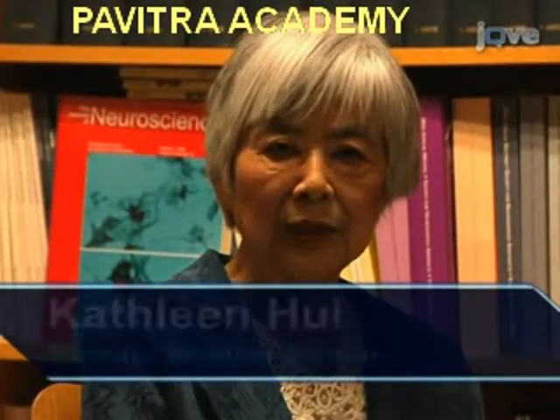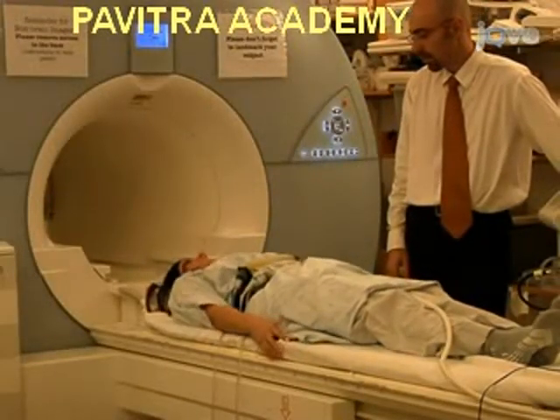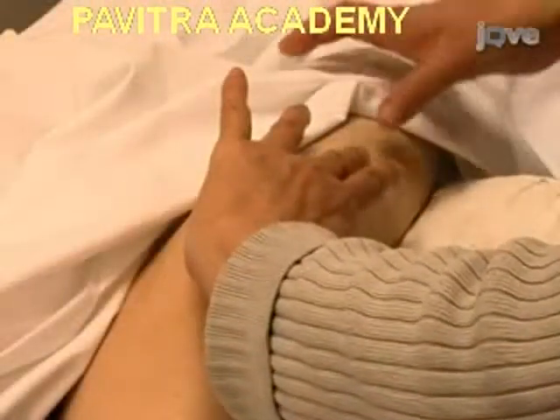Hi, I'm Kathleen Hui from the Martino Center in the Department of Radiology at Massachusetts General Hospital and Harvard Medical School. Today, we will show you a procedure for functional magnetic resonance imaging during acupuncture stimulation.